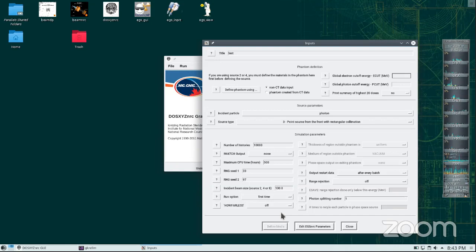So what happens with the Monte Carlo simulation is that it transports the particle to the boundary, and then from the boundary it figures out how it's going to go into the new medium. Of course, once you have these questions, what's my boundary, how far is the boundary in my direction, and so on, that results in more simulation time.